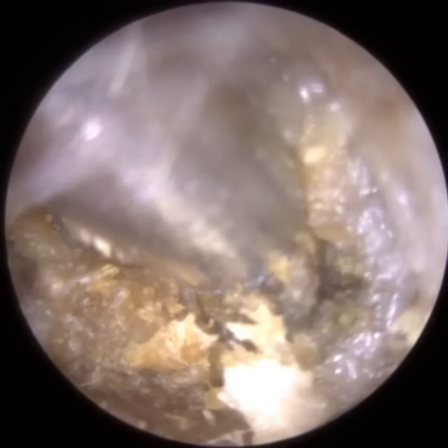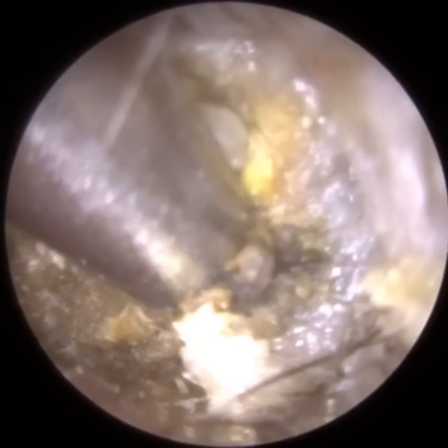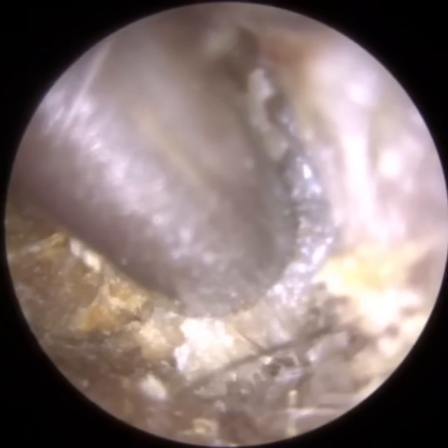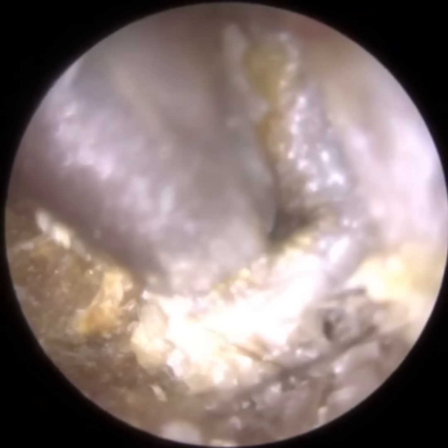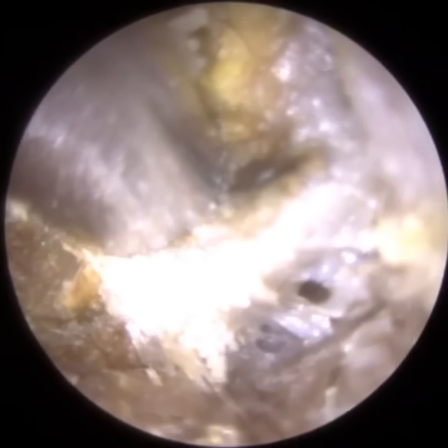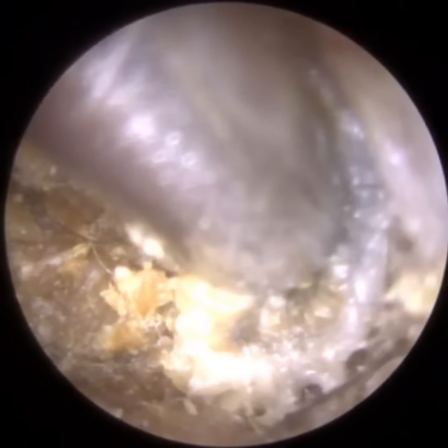And when you get a bit of bleeding in the ear canal, we typically grade. Keratosis obturans has different grading systems. Grade 1 is the mildest form, grade 4 is the most severe form. When you've got a significant widening of the ear canal and a bit of bleeding, we would grade that grade 3 or grade 4. I would say this is more grade 3 than 4.